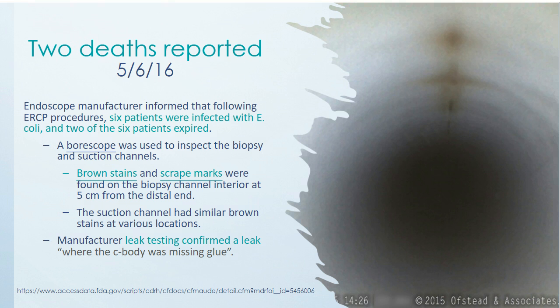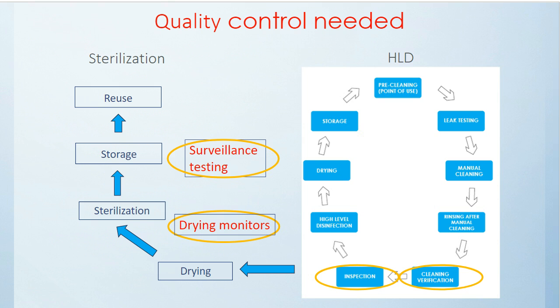And that's why we stress, as does SGNA, they do stress this inspection step, looking at least externally as your safety step, your timeout to make sure that everything looks in good condition. We don't see repair issues or debris left on that scope. Next slide then, talking more about quality control.